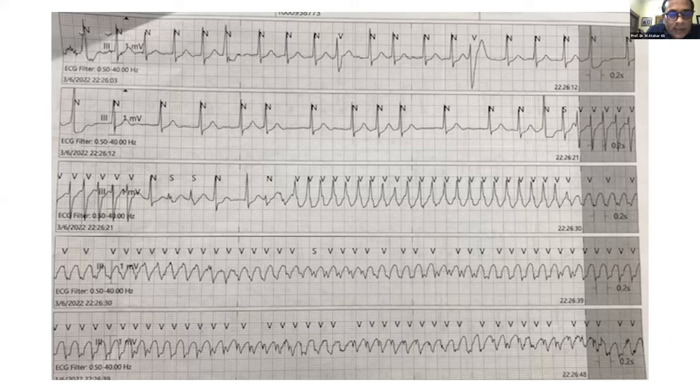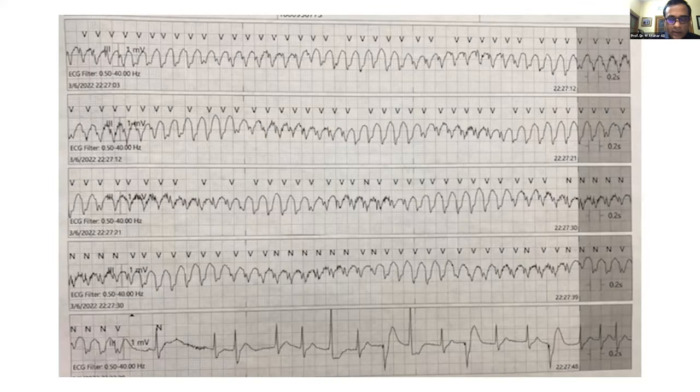So this is in favor of the AFib because the initial part clearly shows the irregularity of the RR interval and there is no P wave. So the initial part of the strip is in favor of atrial fibrillation. Just before the wide QRS complex, there is a long-short interval: a short pause, long pause, short pause. These pauses can cause variation of the refractory period and cause widening of the QRS complexes. And this widening is not against AFib, because the widening is in the same direction as the previous conducted beat. If it were VT, it should usually go in the opposite direction. You see, the direction is the same: the conducted QRS and the wide QRS are in the same direction. Usually in VT, it should go downwards. So irregularity and the same direction are in favor of AFib with aberrancy.